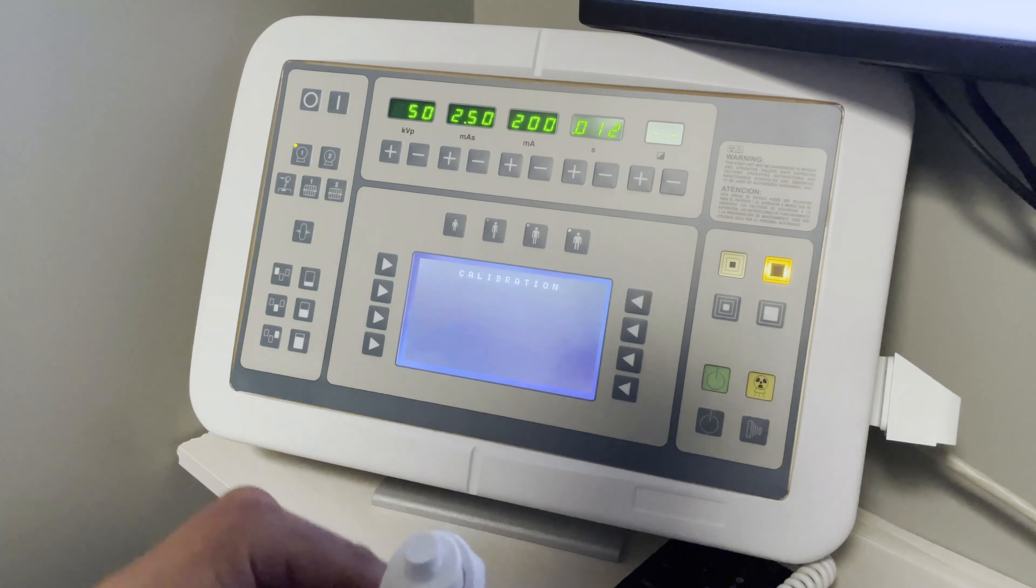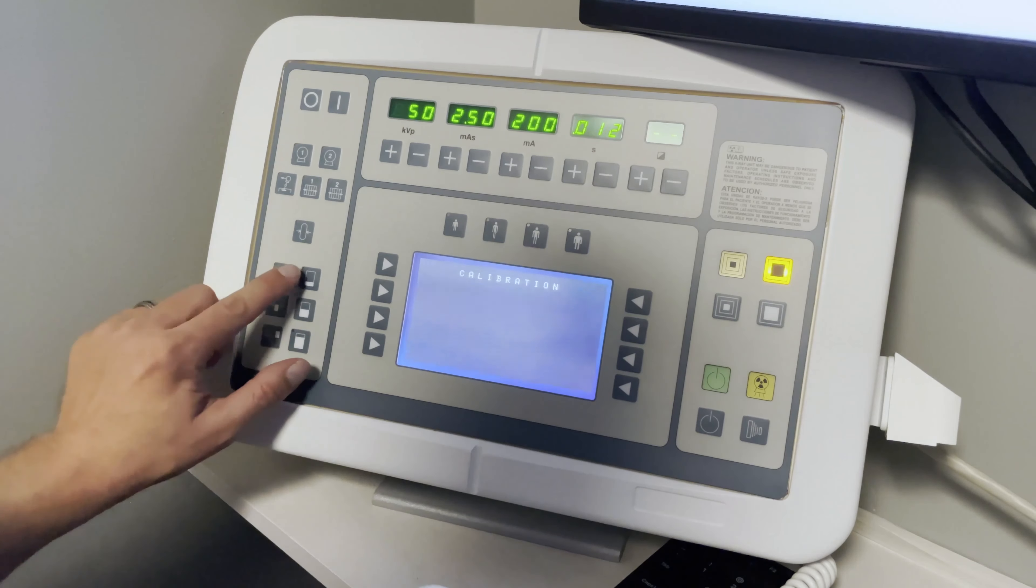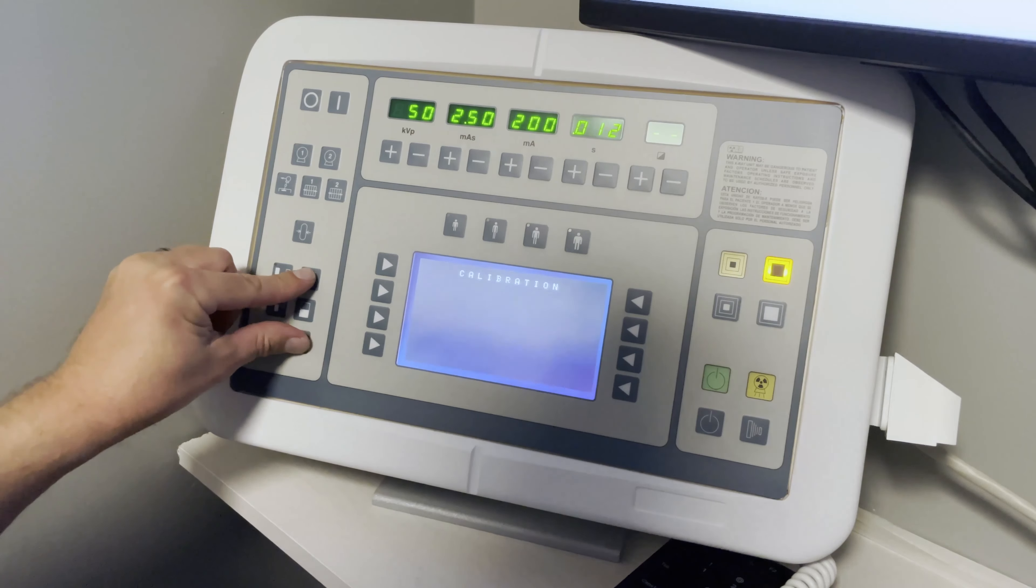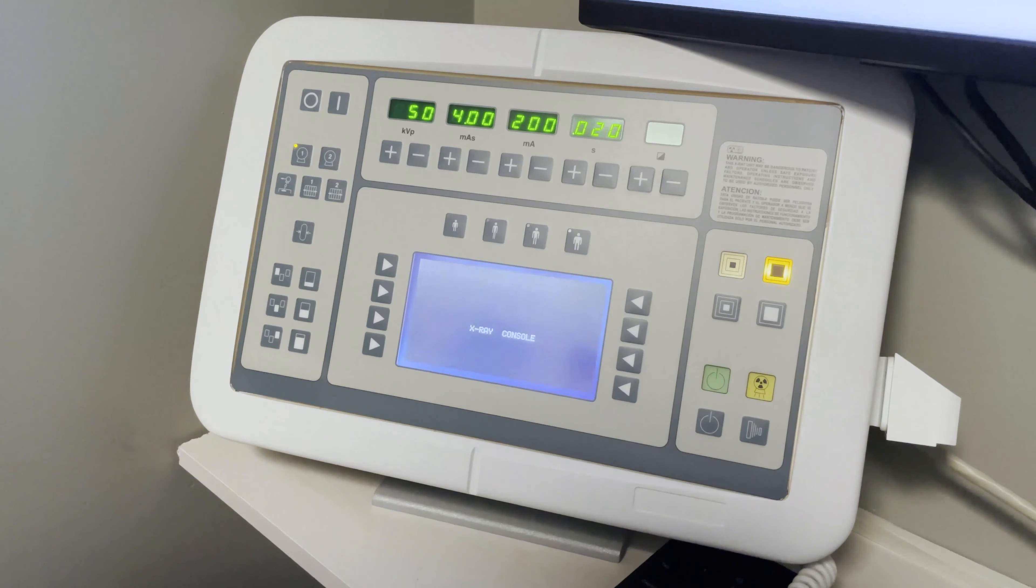After hitting the I button to get out of calibration mode, you want to press the 200 and the 800 button here at the same time. And that brings you back to the X-ray console.